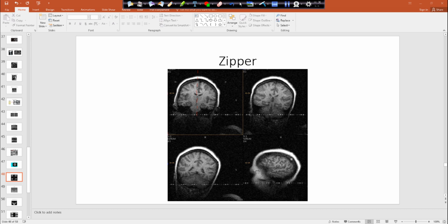So it's happened to me before. We had an EKG monitor that was outside, one of the MRI safe ones, and I guess since it was on most of the time, it was producing this. There were a couple of teeth missing after wear and tear over the years. We had to replace that, and it eliminated it.